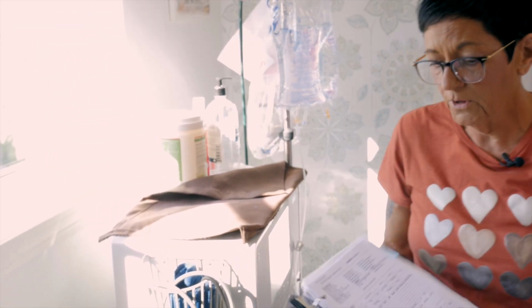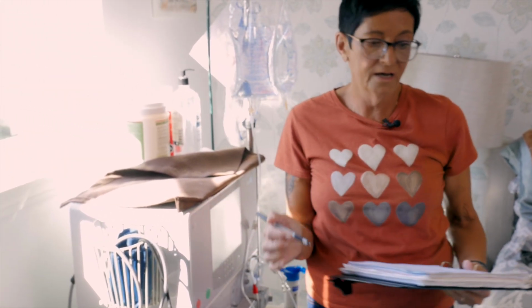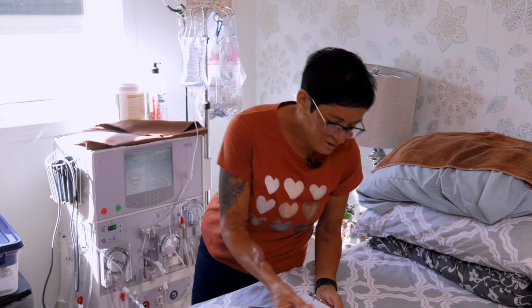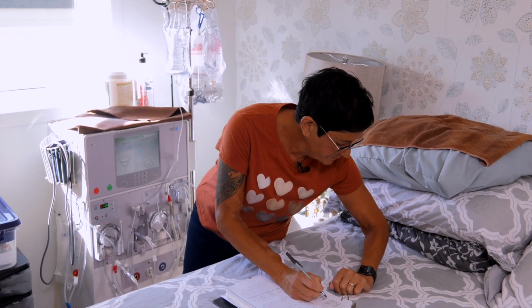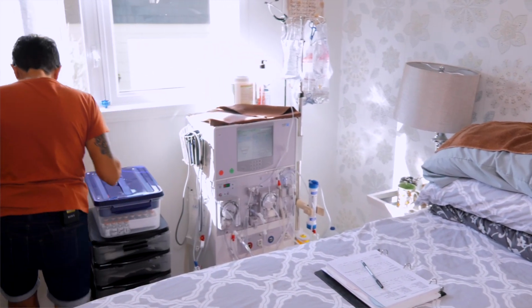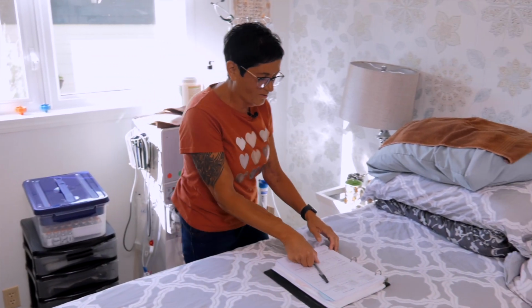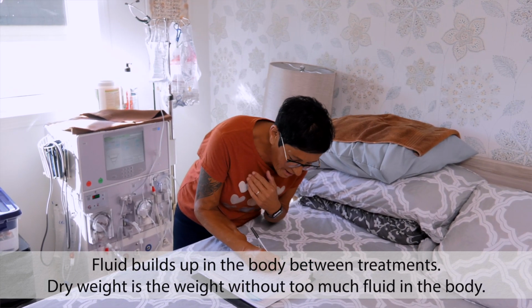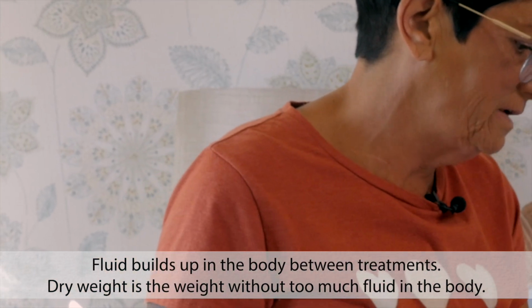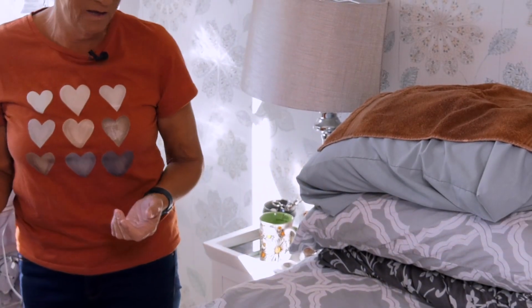And then this is the flow sheet. It's very similar to what they use in center, but because I do 8-hour nightly treatments, I only record my start pressures and my end pressures in the morning. And of course, have to weigh ourselves. Great for the ego. Daily. So I do put your dry weight in, or what you weigh now and what your dry weight is. So what I would have to take off for this treatment is 0.8 of a kilo. I've only gained 0.8 since yesterday.